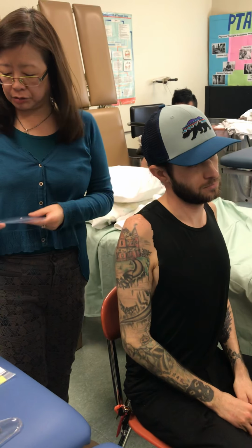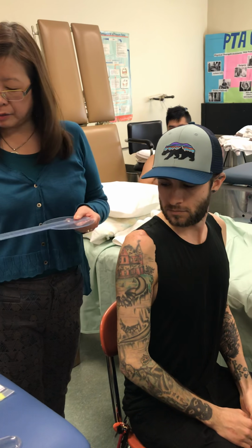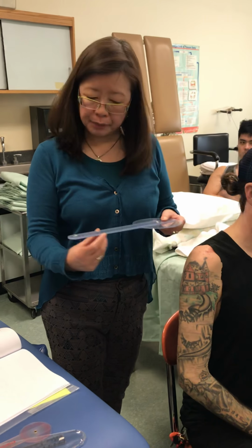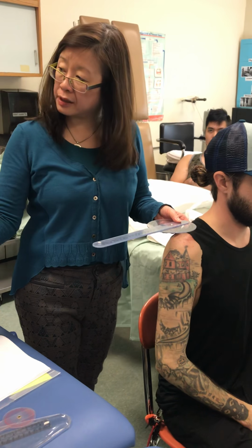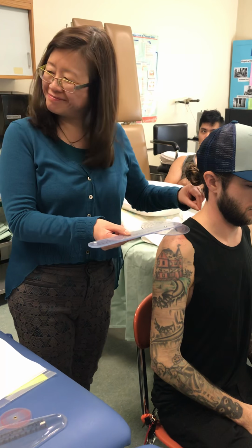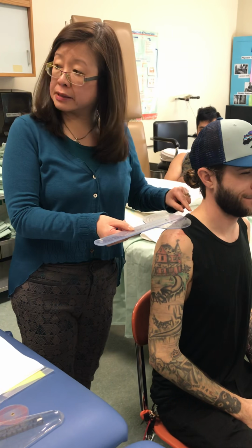So I'm going to use a regular size goniometer, and I'm going to have the proximal arm lined up with the base of the neck, but extended this way, so he's going to be comfortable. I use my imagination, that imaginary part. Still lined up to the base of the neck.